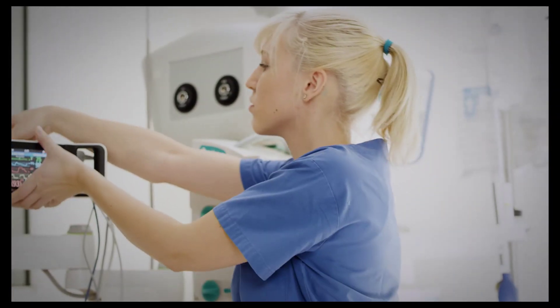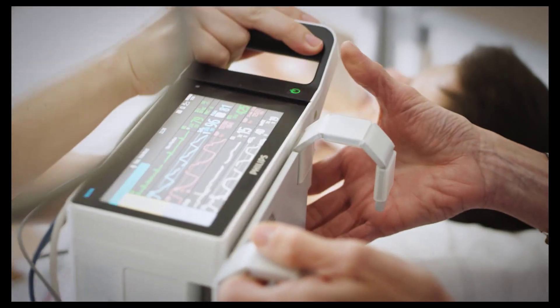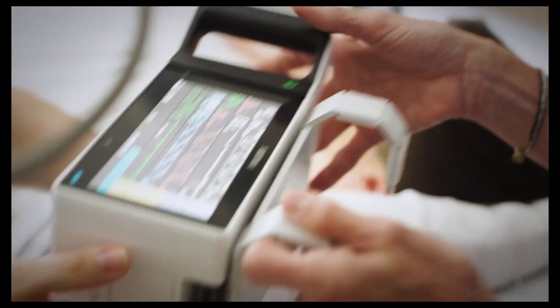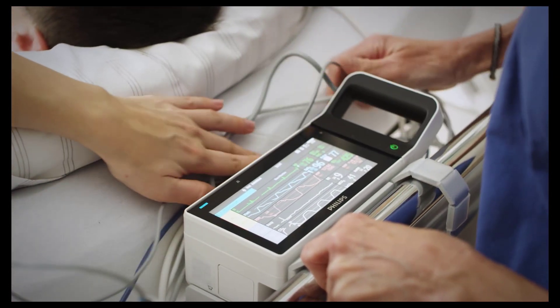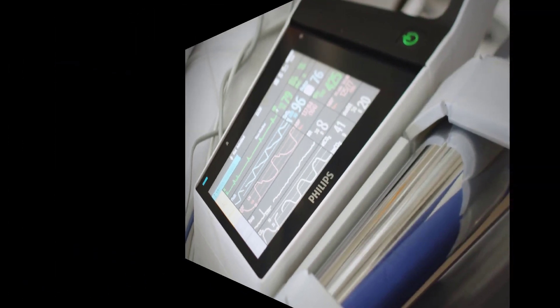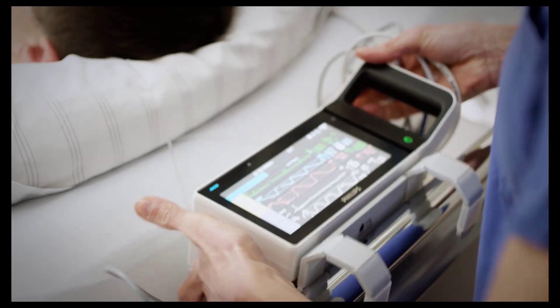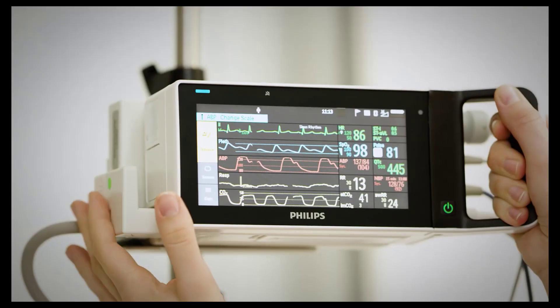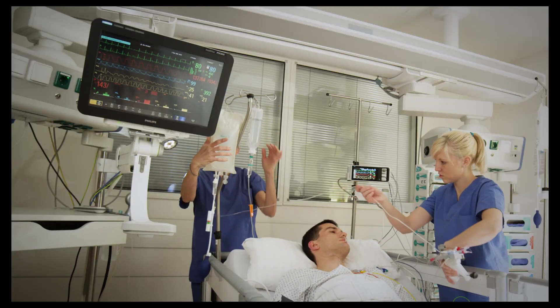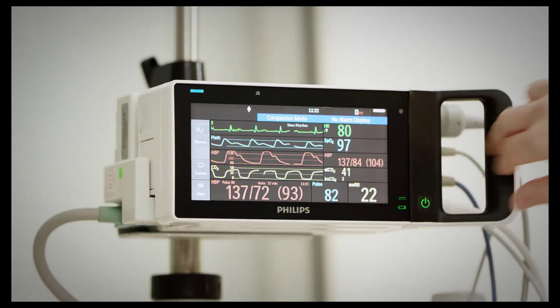The X3 is particularly suited for transport situations. When the X3 is disconnected from the original host monitor, it continues to monitor the patient as a standalone monitor. When connected to a new host monitor, it resumes its role as a multi-measurement module. It can upload trend data, patient demographic information, and measurement settings, allowing for full continuous monitoring.